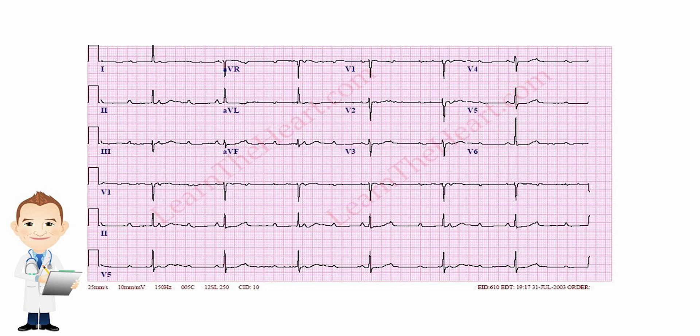The PR interval is quite long, then the next QRS it's really, really short, the next one's kind of in between, then the next one's short again. When they have a variable PR interval like that, it's most likely to be third-degree heart block.